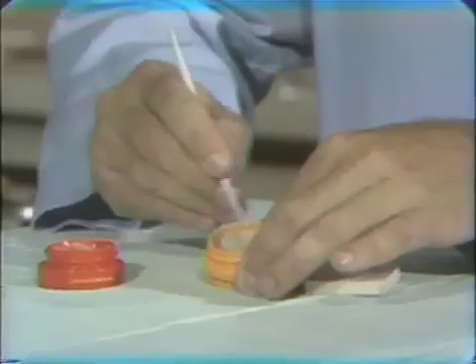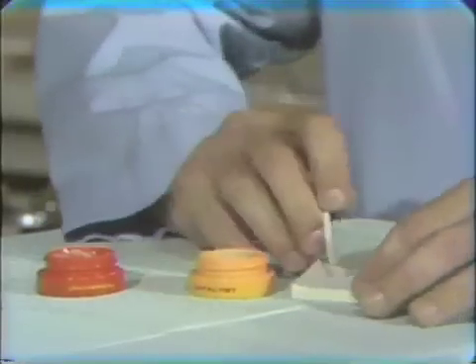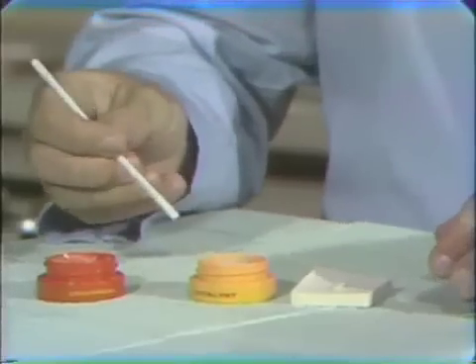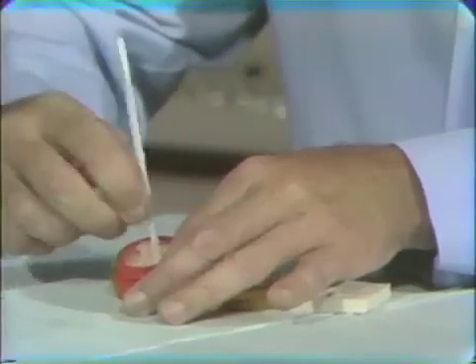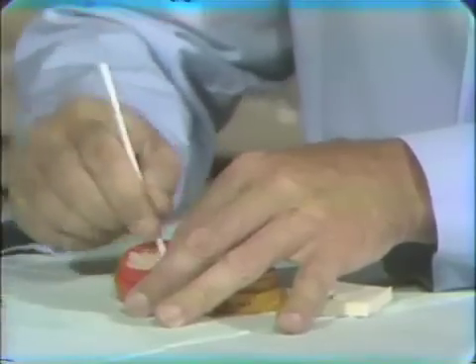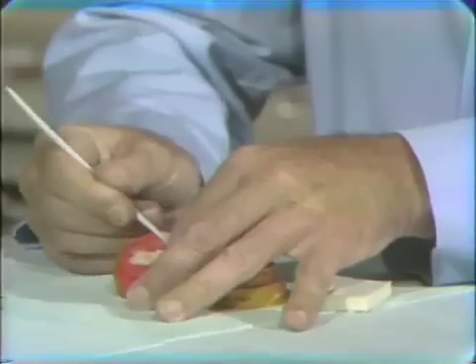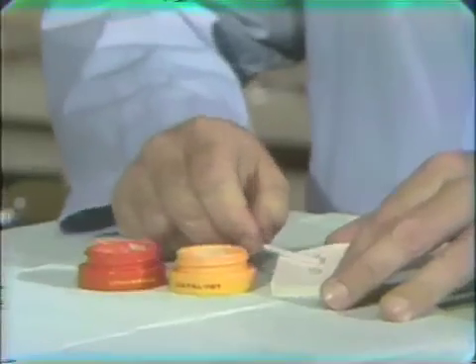Small amounts are taken out and dispensed. It's a very expensive material, and you do not need a lot of it to fill most of our preparations. With this paste system, we now turn the spatula and take out the universal paste, but we use equal amounts of each. A very simple method of mixing. We are stirring this. As you noticed, he stirred the catalyst, and now he stirs the universal paste. The manufacturers say this is not necessary, that it's homogenized, but we feel that we get better results if every day, at least, these are stirred.